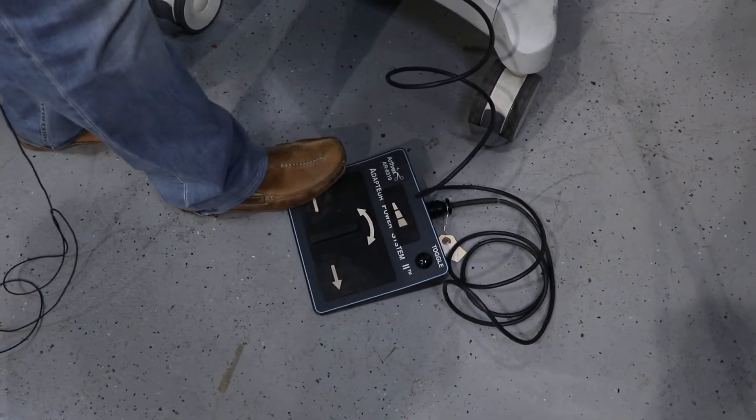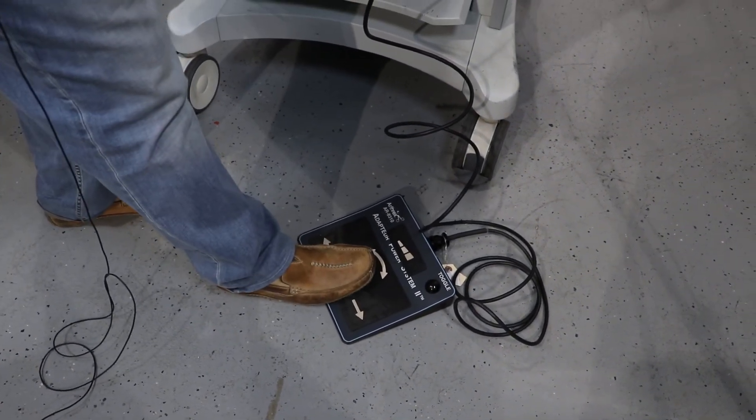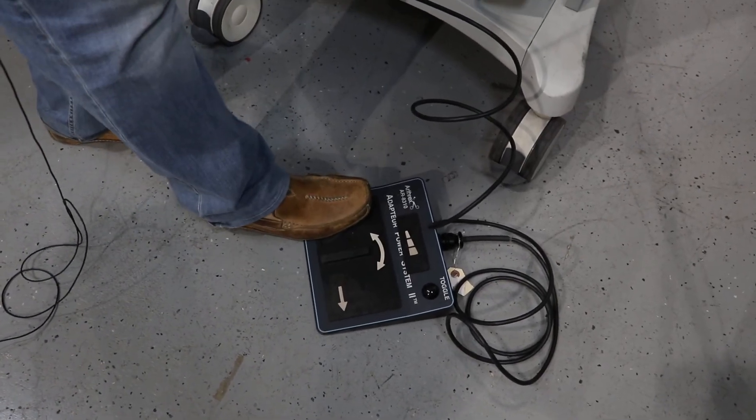The shaver operates in three modes: forward, reverse, and oscillate in the oscillation mode. So you have three modes that you can use for the system.